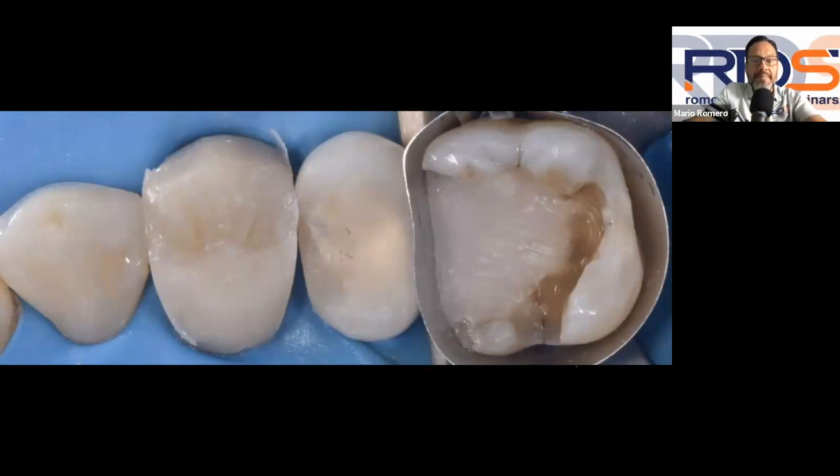Now, once I am able to light cure this margin, I can go ahead and use a diamond burr or any type of burrs, and I can smooth it out. I can bring it down, because obviously you want to have that elevated margin below the contact area of the proximal tooth. And the reason is because you want to reestablish contact in between these two teeth by means of a resin composite, of a nano hybrid or nano filled resin composite. So I cut back a little bit of the material. I make sure that this resin modified glass ionomer is below the contact area.